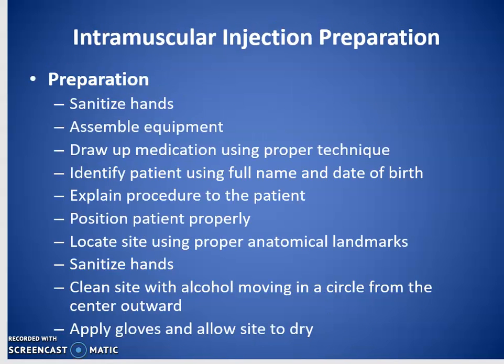In preparation, this is for all injections. It's really for all medical procedures, period. You should be following these steps every time you lay hands on a patient, in terms of sanitizing hands, getting your equipment together, drawing up the medication, identifying. Most of these things are standard medical procedures, so just have them in your routine. Some of these items, of course, are specific to injections, and they are good advice, so I definitely would follow them.